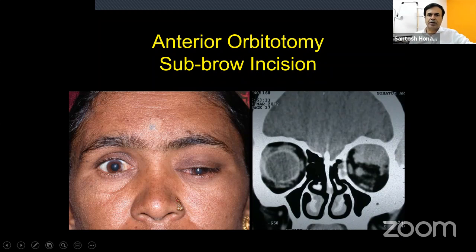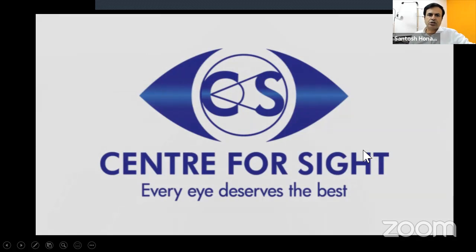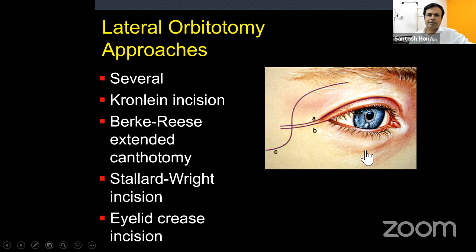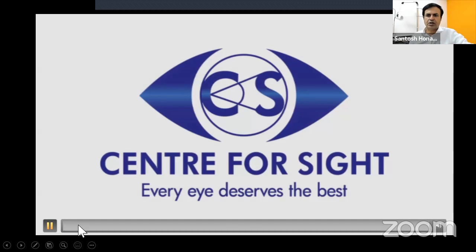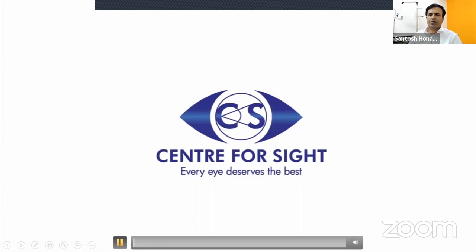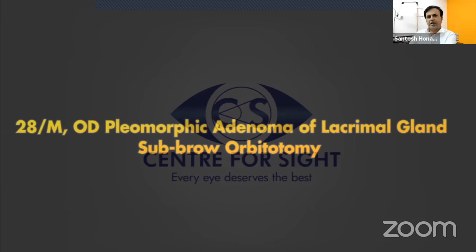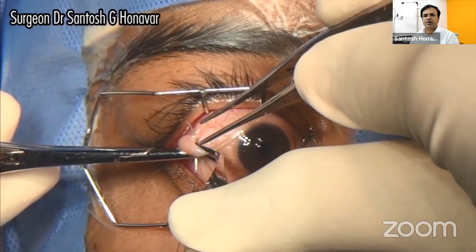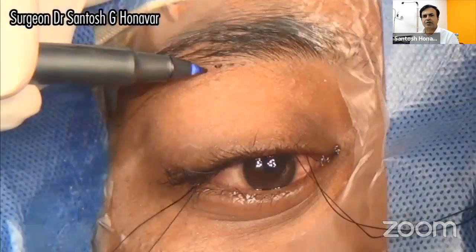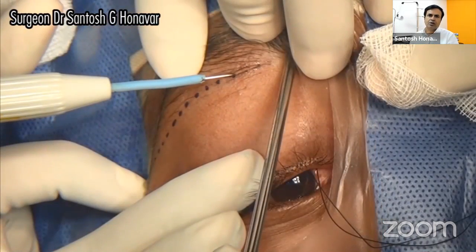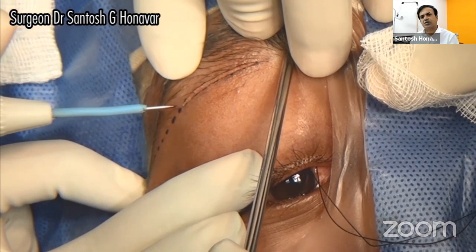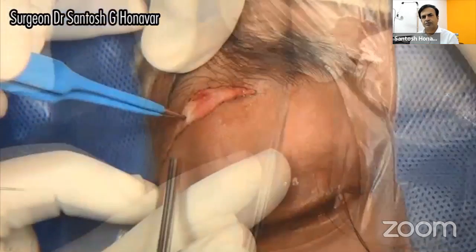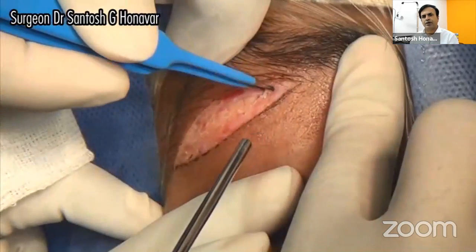For a lacrimal gland tumor with a bone defect — suggesting possible pleomorphic adenoma with malignant transformation — avoid the lid crease incision when malignancy is suspected. Use a supratemporal direct approach right on top of the lesion. Dissect through orbicularis, approach the superior orbital margin and periosteum, and prepare for a possible bone cut — though it may not always be needed. Make a periosteal incision 3–4 mm from the superior orbital margin, extending laterally to where the tumor lies.